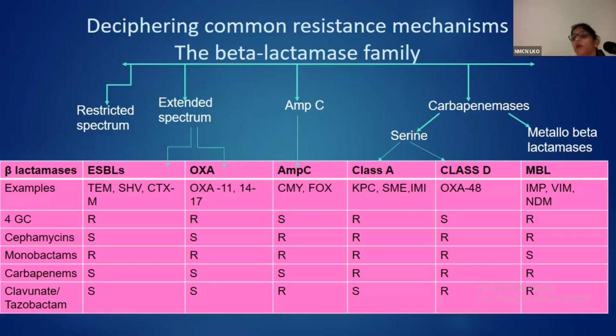For all these carbapenemases, the pathogens will be resistant to the carbapenems. For MBL specifically, the metallo-beta-lactamases, the resistance is not shown for monobactams, aztreonam, right? So for NDM, if it is resistant to all the drugs except monobactams, what can be the possible treatment choices? Anyone? Treatment choices for MBLs? Polymyxins, yes. Colistin. Not monotherapy; dual therapy or triple therapy may be given.